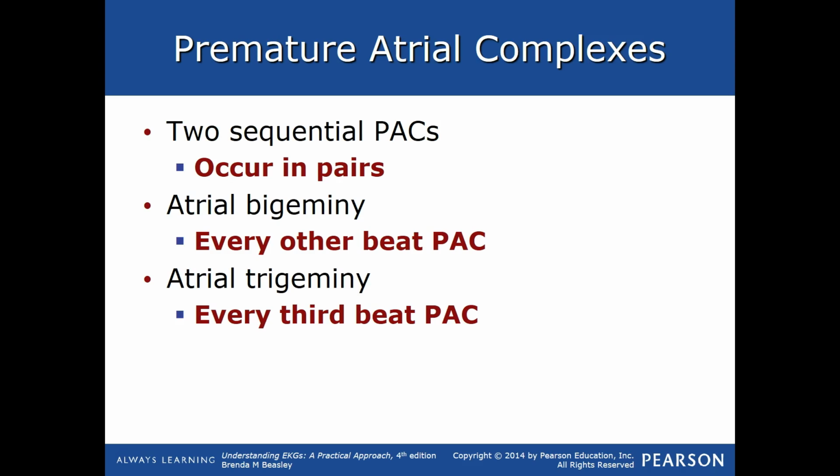Now, this is something to pay attention to, because you'll see this over and over within EKG. So two sequential PACs, meaning you have a pair of them, then you would call that two sequential PACs, or you may even see the word couplet. From me, you're probably going to hear the word couplet rather than sequential, but just recognize both.